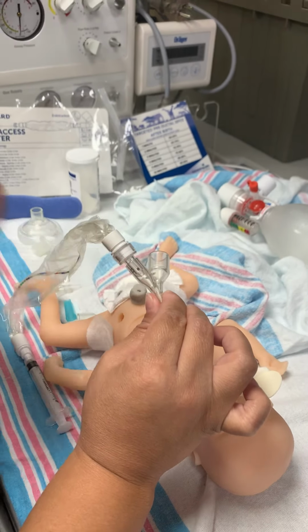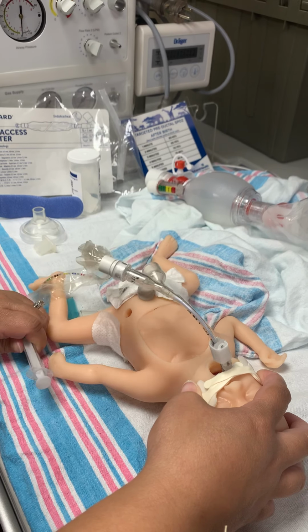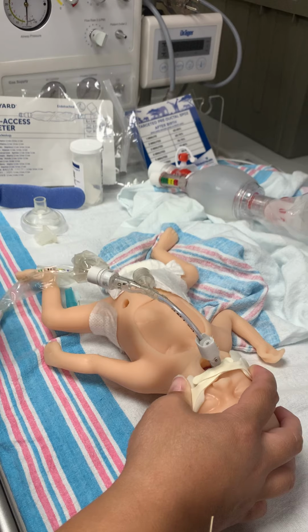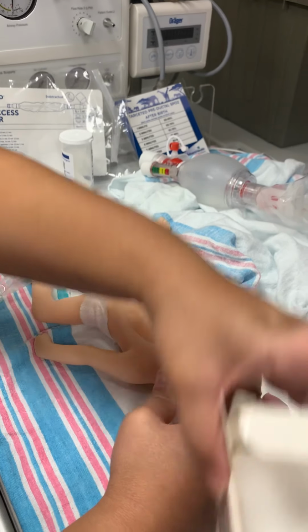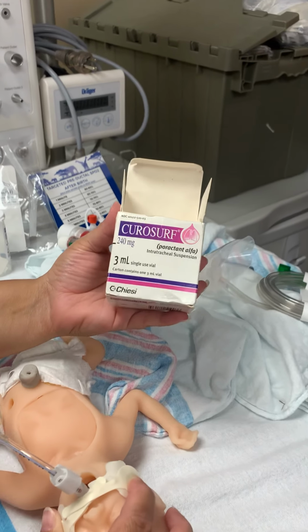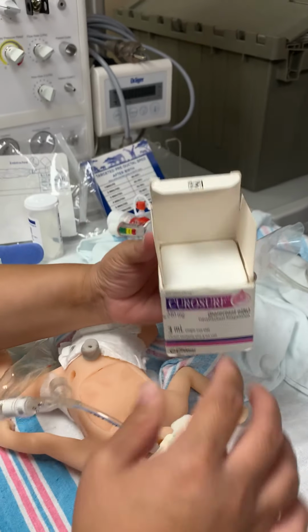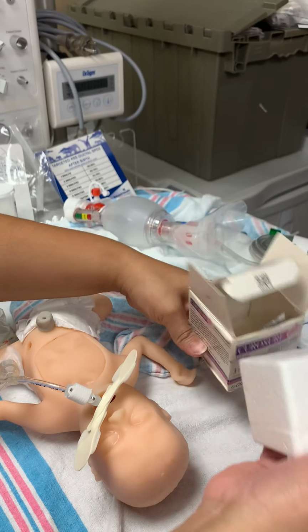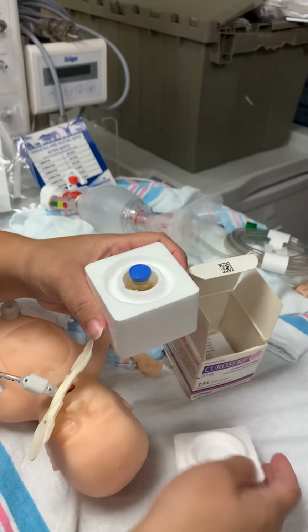So from previous education, we know that we are to draw up initial dose, or loading dose is 2.5 mLs per kilo of CuroSurf. So the CuroSurf comes in a box like this, but pharmacy may or may not take it out of the box, and you may only have the vial. Is the vial in here? The vial is in there.